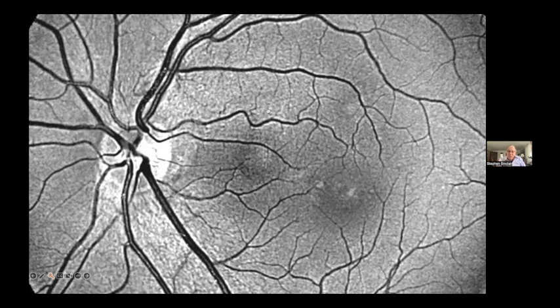And we're now recognizing that, I don't know whether this area here, this is a microaneurysm that's starting to fibrose around the edges of those endothelium.